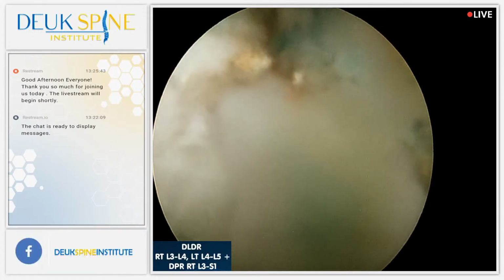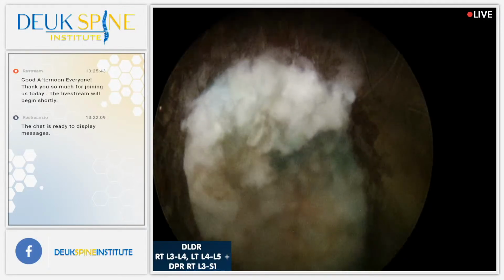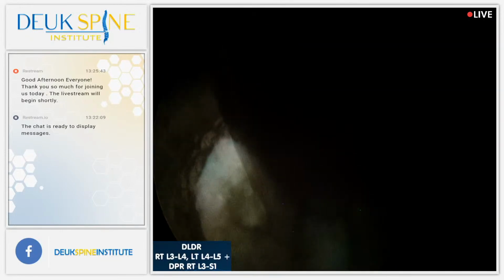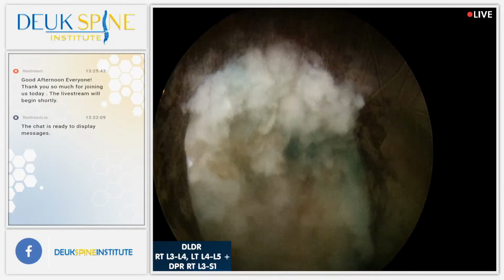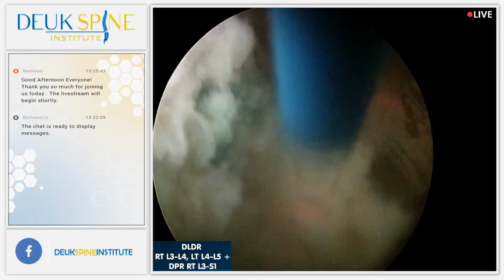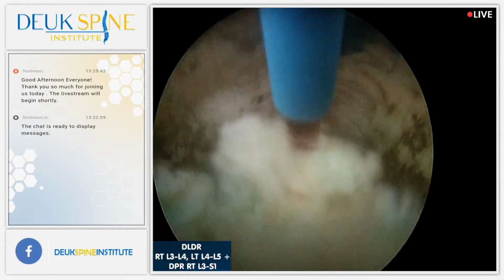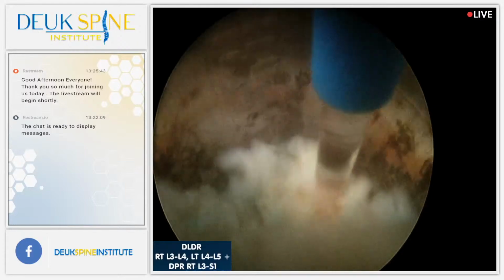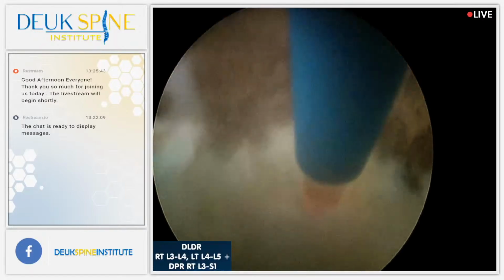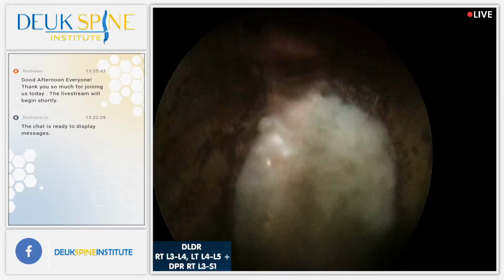Okay, great. Welcome back. And now you see how the Deuk laser disc repair surgery works. It really targets the source of back pain, which is the inflammation within the annular tear. By cleaning out the annular tear, we call that a debridement. We're removing not just the herniation stuck in the tear, but also scar tissue, dystrophic calcium deposits, this orange stuff here, and inflammatory tissue that's in there. So there's a lot of debris, scar tissue, inflammatory tissue, calcium deposits, and herniated nucleus pulposus. That's really what we're removing.